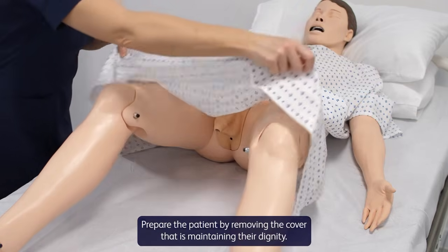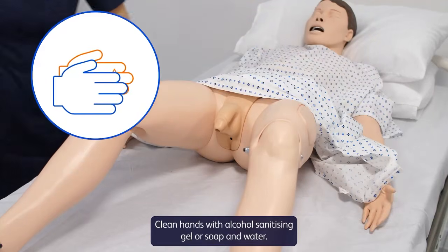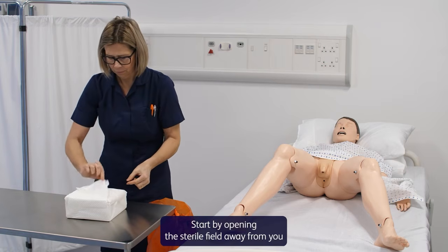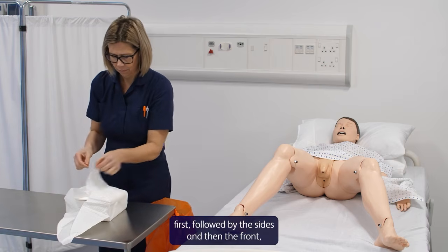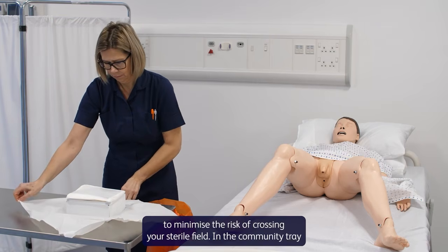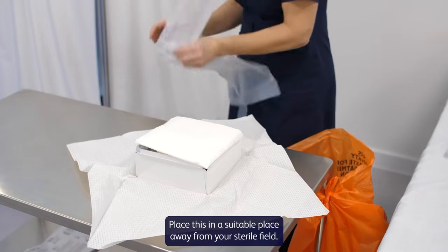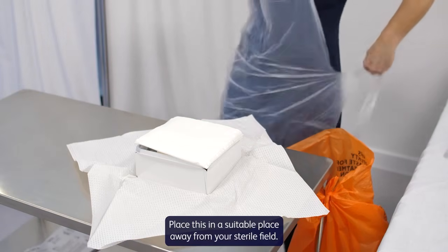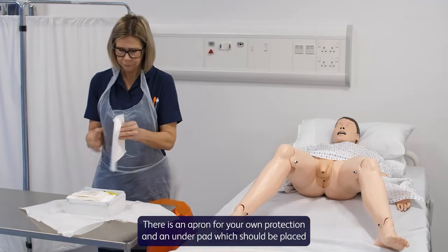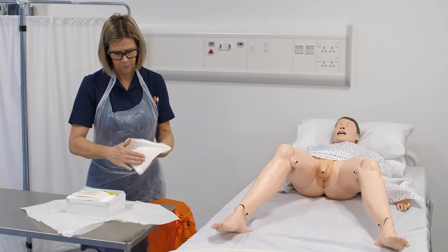Prepare the patient by removing the cover that is maintaining their dignity. Clean hands with alcohol sanitizing gel or soap and water. Start by opening the sterile field away from you first, followed by the sides and then the front to minimize the risk of crossing your sterile field. In the community tray, the first item is the waste bag. Place this in a suitable place away from your sterile field. There is an apron for your own protection and an underpad which should be placed beneath the patient's buttocks, ensuring the shiny side is facing downwards.